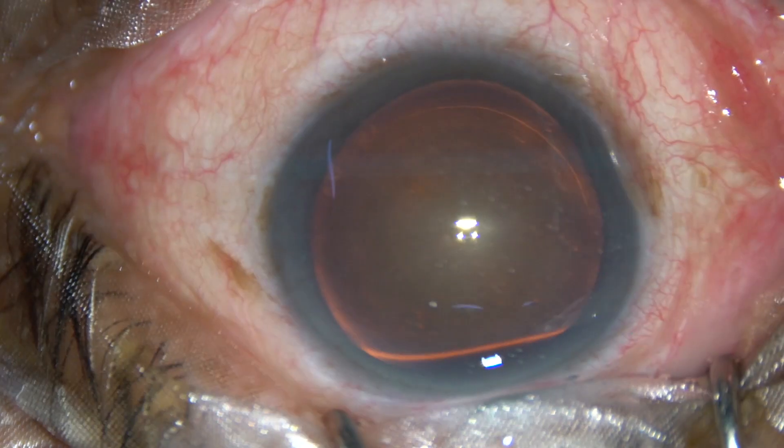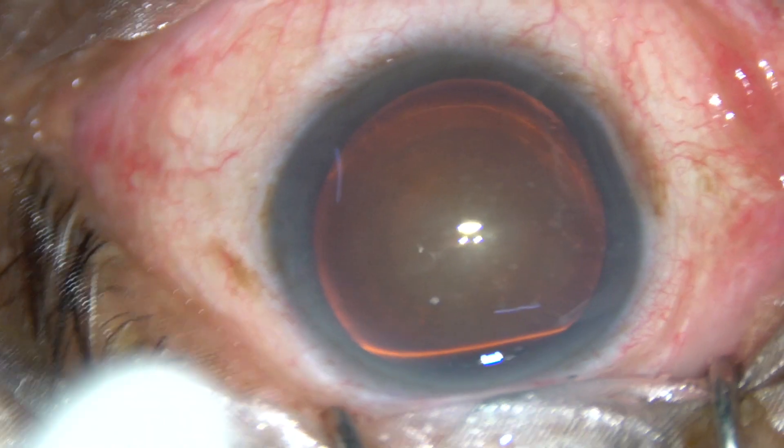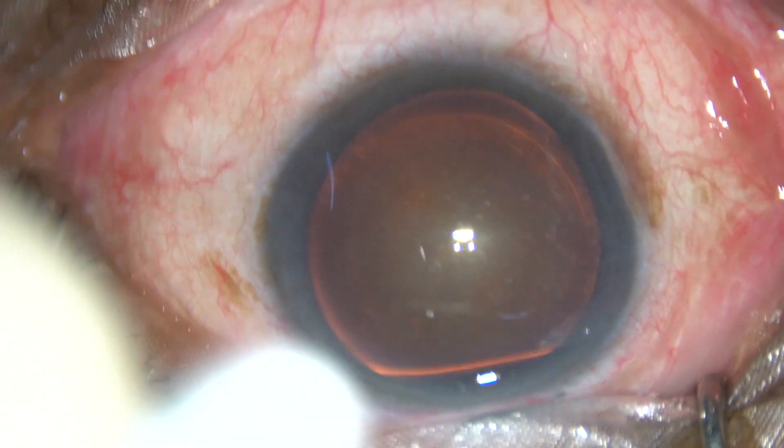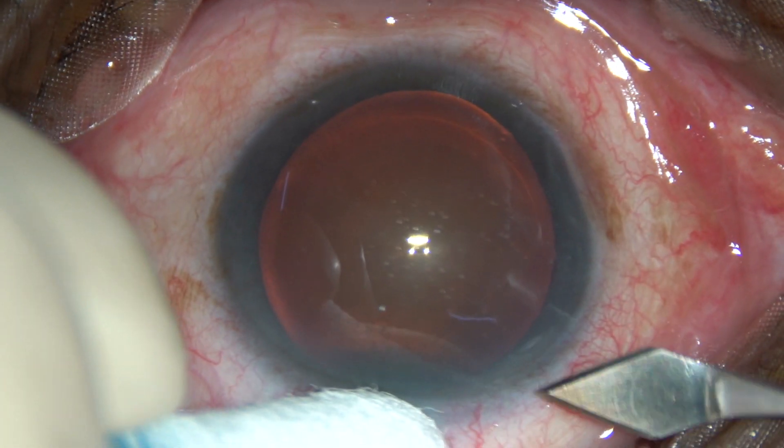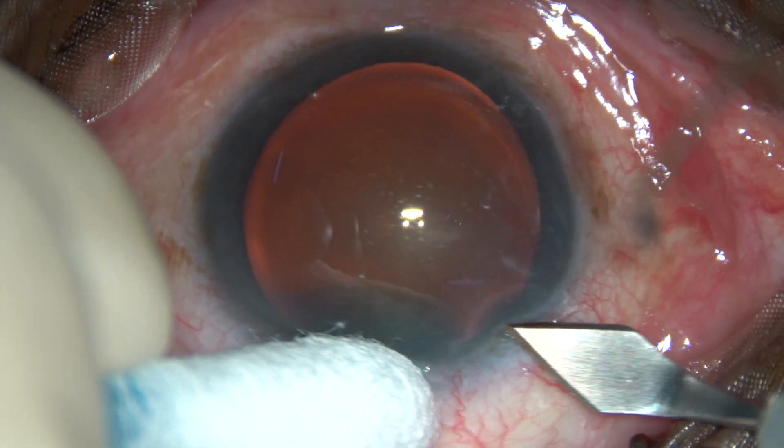Dear colleagues, this is a 7-minute long video and you are going to watch Submarine Chop. You can see this is a cataract with grade 3 plus or grade 4 nuclear sclerosis.